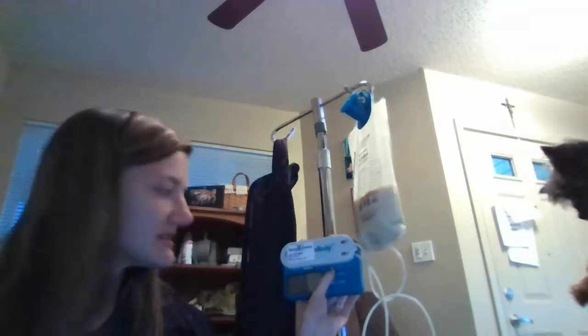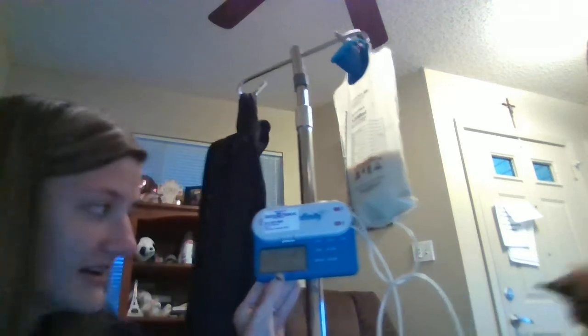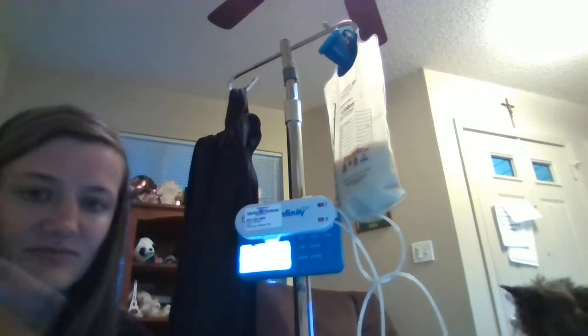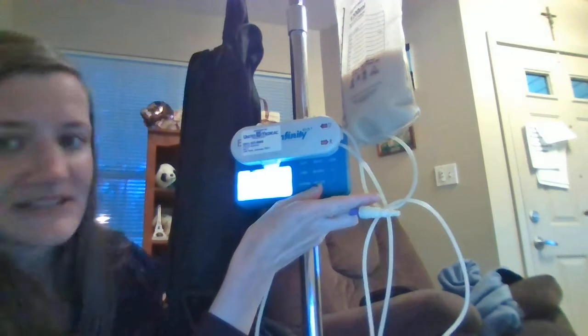So what I'll do is I'll press. It's really hard to see. I am so sorry. It's probably backwards. You press the on button. You hold it down. Wow, the camera's really bad. Focusing. Oh well. Anyways, it says 50 mLs on it.